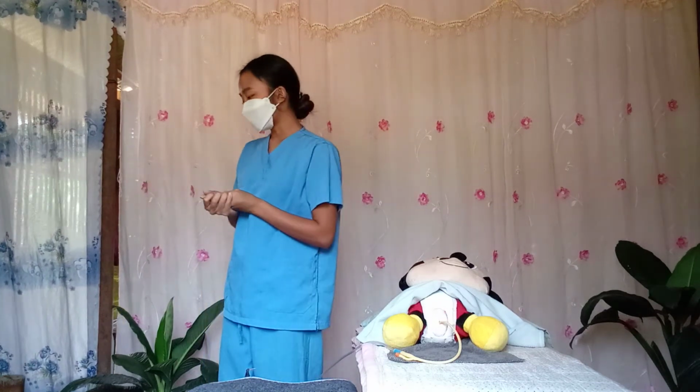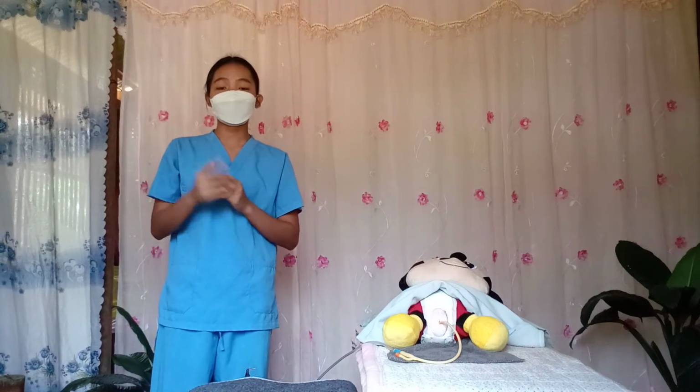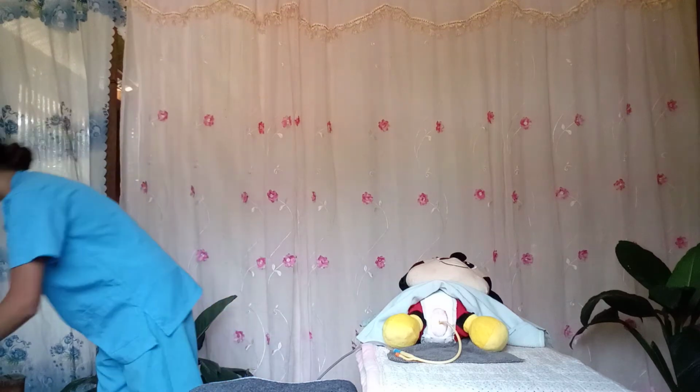So, the next thing that I am going to do is remove the catheter from the patient's urethra. Upon removing the catheter from the urethra of the patient, we should stick to the doctor's order, if we are ready for removing the catheter. So, the next thing that I am going to do is use another syringe, because the syringe that we used earlier is for single use only. So, we will be getting another syringe.